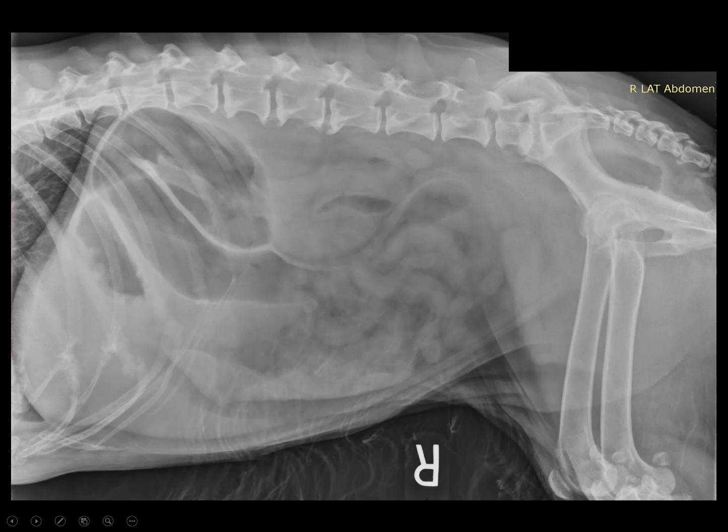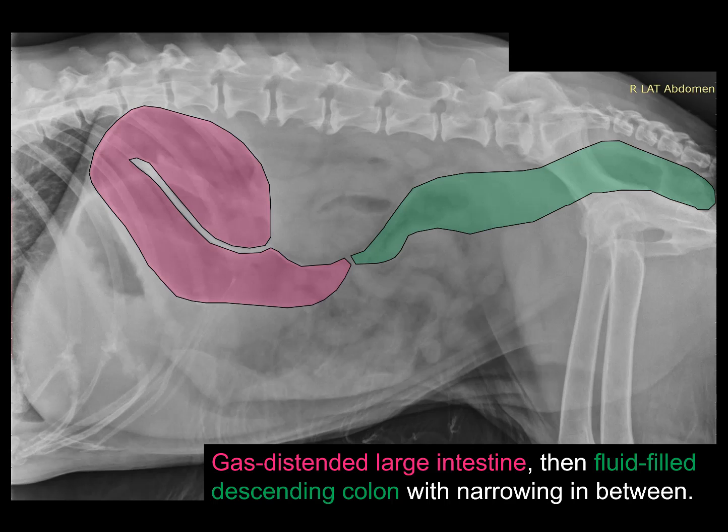And so it's a little bit weird how we have this abnormal sort of combination of two parts of a large intestine. But it's certainly not definitive on the basis of this lateral view, so I want to see the ventrodorsal projection. Again, there's your parts for your notes.